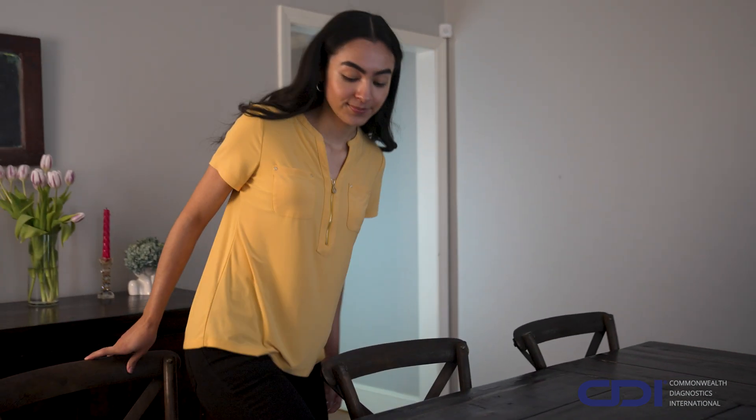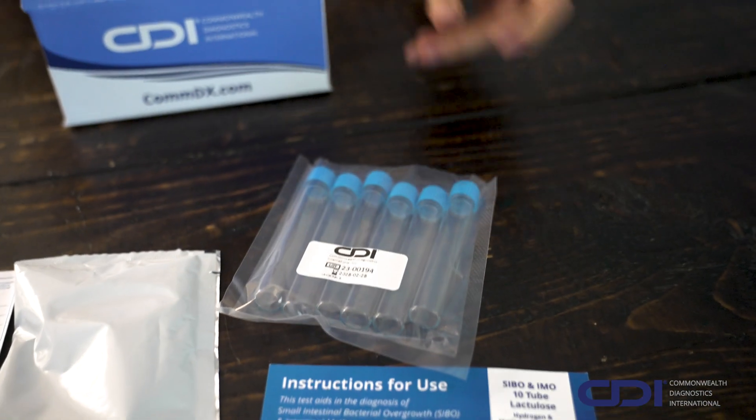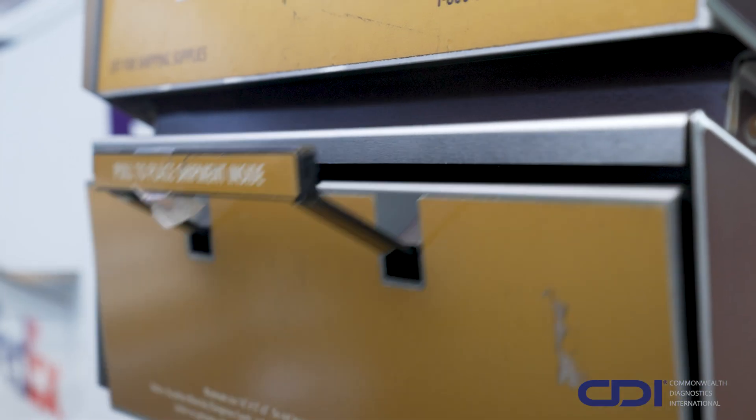Welcome to your instructional guide on properly taking CDI's hydrogen and methane breath test for SIBO and IMO. Whether using the 10-tube kit for yourself or helping facilitate the 6-tube pediatric kit for a child, this video will ensure you're fully prepared to complete your tests safely, quickly, and accurately.